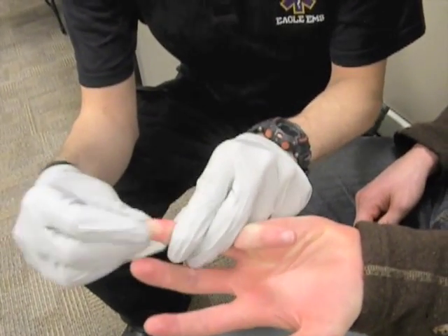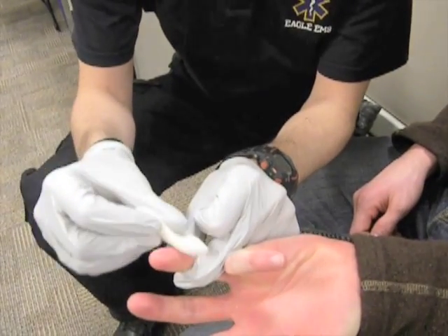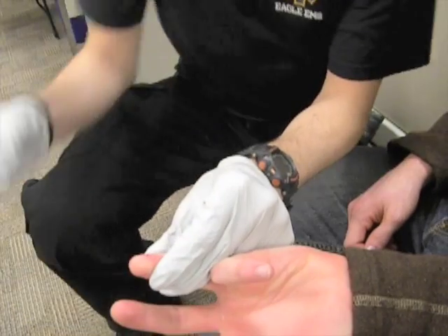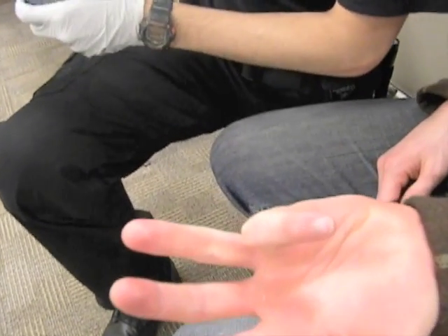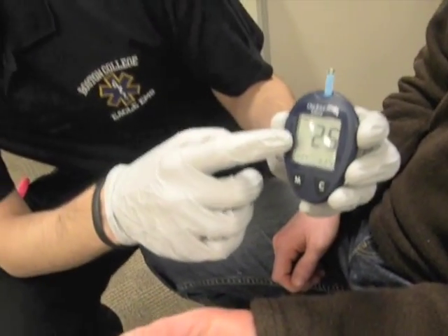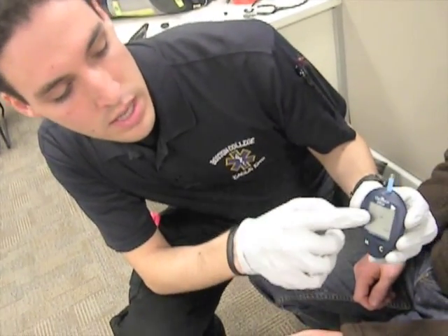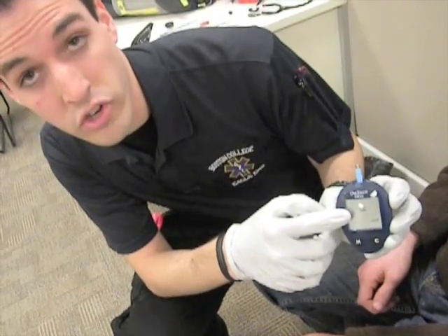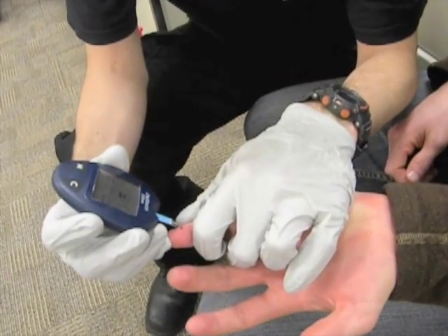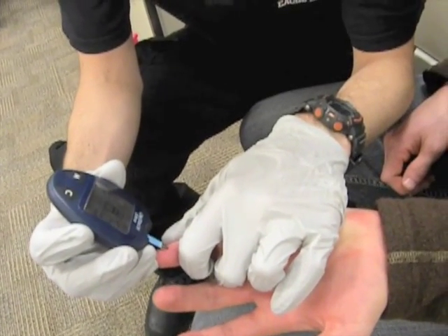We're going to do our best to coax a little blood forward. Wipe away the first drop to make sure the area is dry and clean. The second drop is what we're going to use for the glucometry. When you first put the strip in, you'll see the test number — you need to wait until you see the little blood drop symbol. Then come up to the side of the blood drop and just let the tube pull it up.